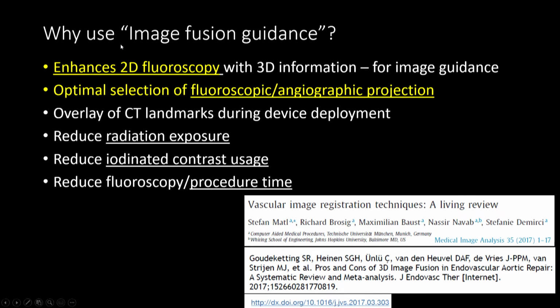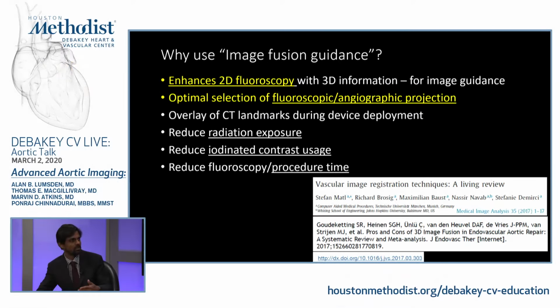Sure. So what we are trying to see is how we automate some of the things that I have shown you, so that a surgeon can load the data set and do most of this post-processing in an automated fashion, and maybe does the validation or cross-checking if that is accurate or not, instead of doing all of this manually. Eventually we're talking about enhancing the 2D fluoroscopy with three-dimensional information, whether it is coming from CT or MR. We can even get that information from ultrasound.